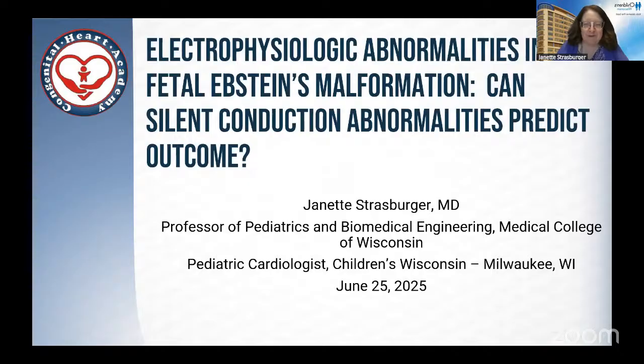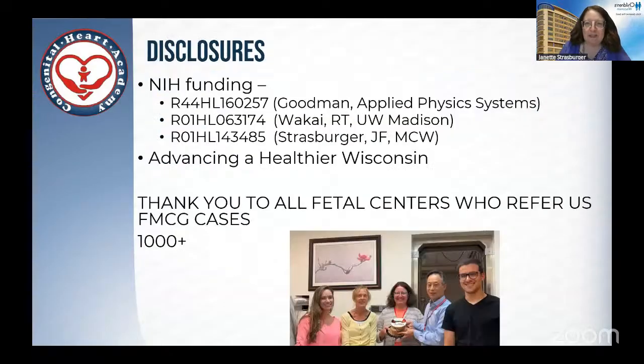More often you hear about the arrhythmias that we see with ultrasound. But what I'm going to be talking about predominantly today is the silent conduction abnormalities and arrhythmias that can only be seen with FMCG or FECG. Unfortunately, FECG doesn't have the quality to be able to see that.